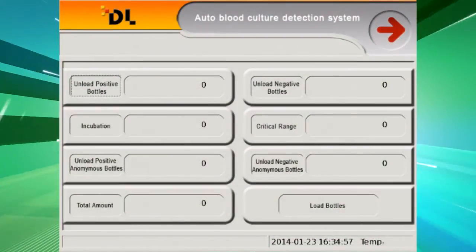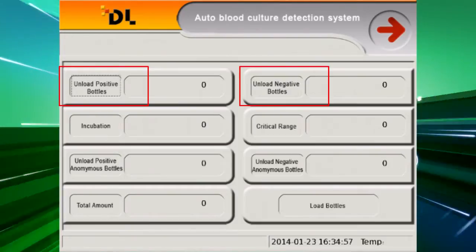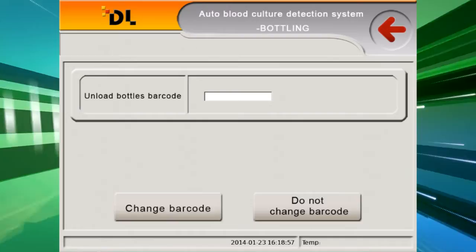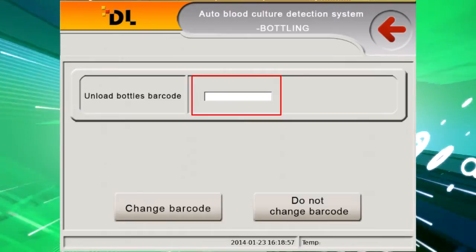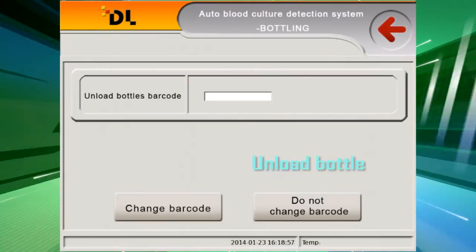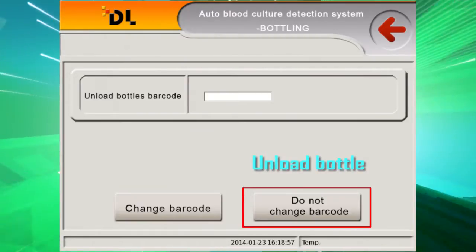Unloading procedure: Press Unload Positive Bottles or Unload Negative Bottles. The unload interface will be displayed. Take out the culture bottle — the barcode and cell number will be shown for verification. Click Confirm. The unloading bottle operation is finished.